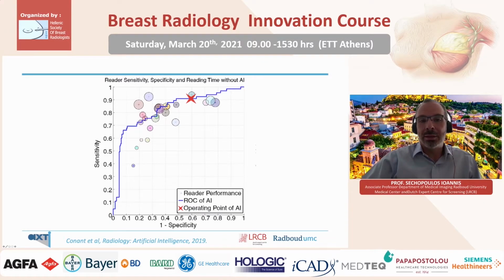In this retrospective study, we saw we would have incorrectly pre-labeled 7% of cancer cases as normal, so those would have been missed, but also the false positive rate would have gone down by 27%. If you want to be more conservative, you can draw that line at a score of 2. You don't get, of course, as much of a reduction in cases to be read, but you don't miss, in essence, any cancers, and you do still increase your specificity a bit.